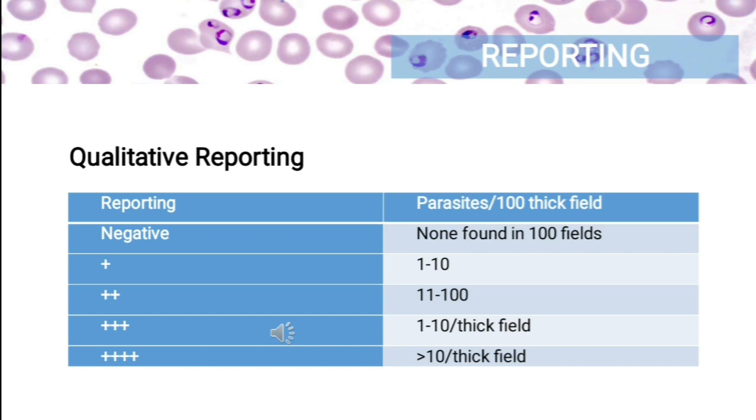Now let us proceed to the reporting of malarial smears. Microscopic examination remains the gold standard for laboratory confirmation of malaria. These tests should be performed immediately when ordered by a healthcare provider. They should not be saved for the most qualified staff to perform or batched for convenience. In addition, these tests should not be sent out to reference laboratories with results available only days to weeks later. It is vital that healthcare providers receive results from these tests within hours in order to appropriately treat their patients infected with malaria.